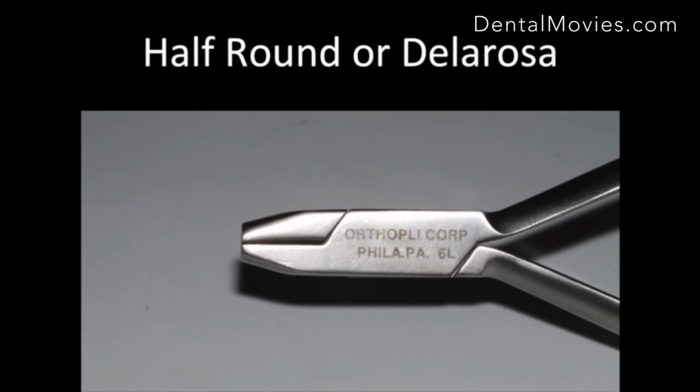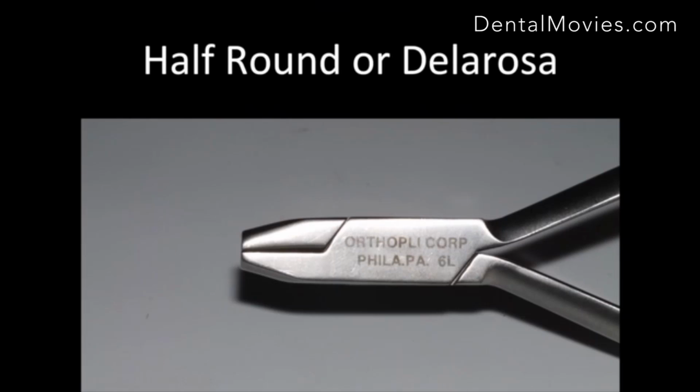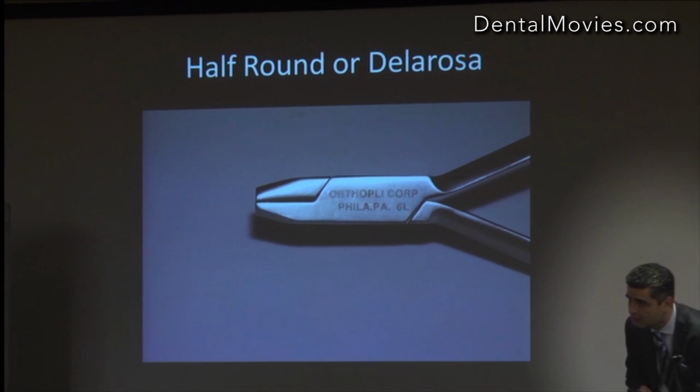Second plier you need is for arch contouring. So when you've got your 18 by 25 in and you take your records and you now want to customize your stainless steel or TMA, you need what's called a Delarosa, also known as a half round. Now, remember I said the worst pliers are the Pakistan ones. They're going to melt in your hands after the first autoclave. The most expensive are the German, but they're also the best quality. My pliers all come from one company called Dentaurum, but they cost a fortune. But the use I get from them, it's worth me paying the extra.